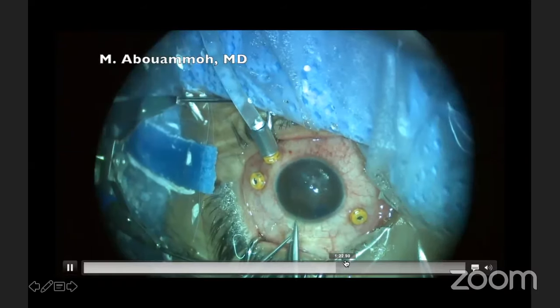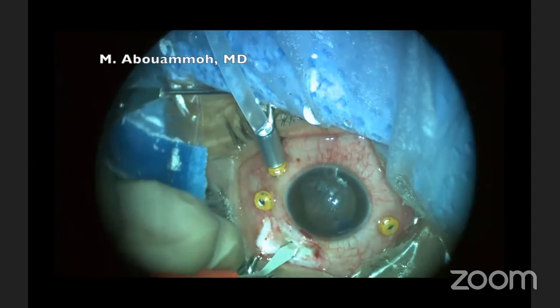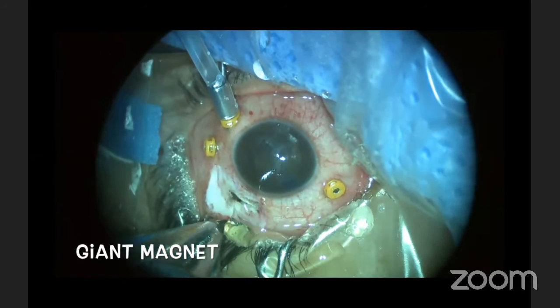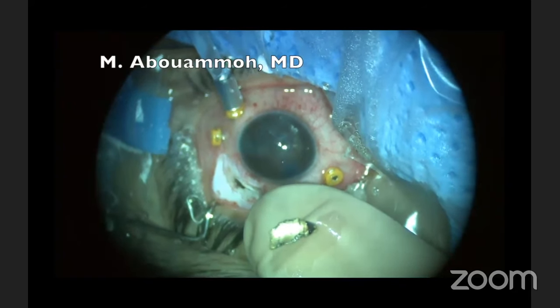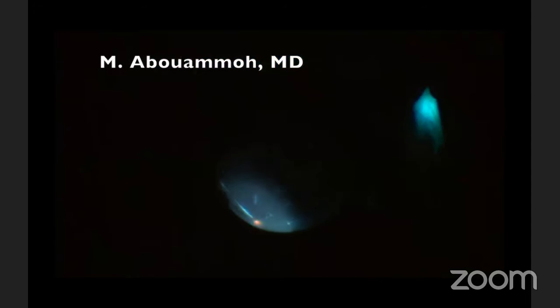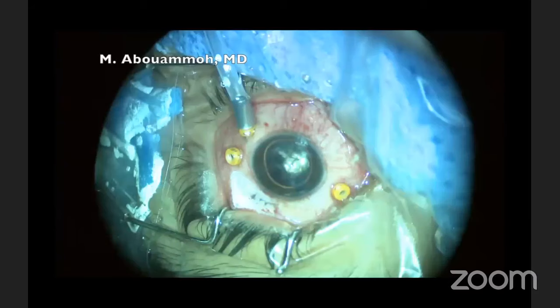Then trim around the foreign body, and then remove it again through a large sclerotomy. We used the keratome blade, and this is the giant magnet in action. You can notice the difference in size. Usually outside the globe, you will find that the foreign body is much larger than when you see it inside the vitreous cavity.